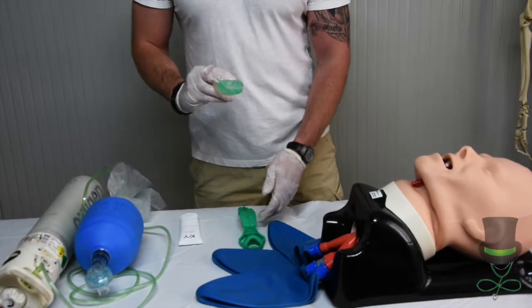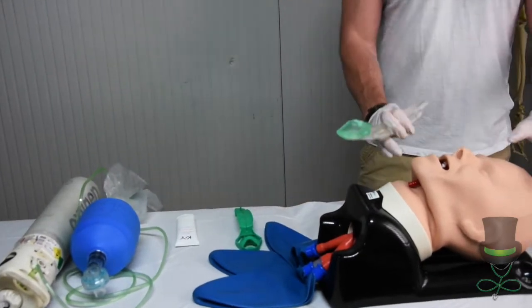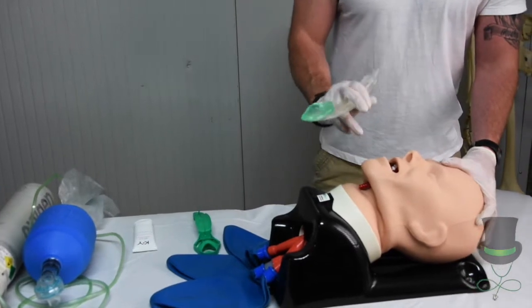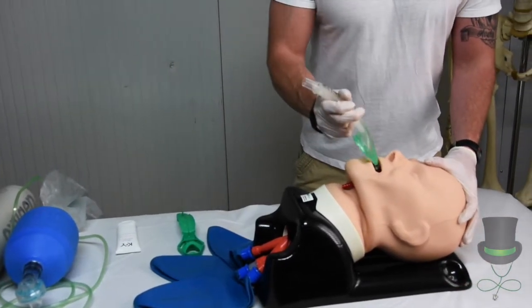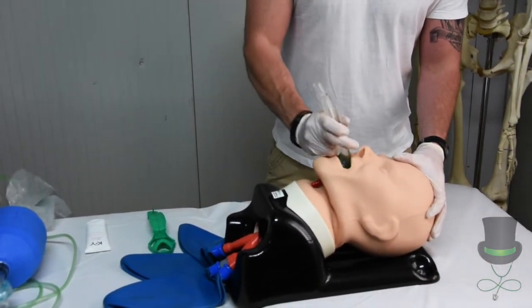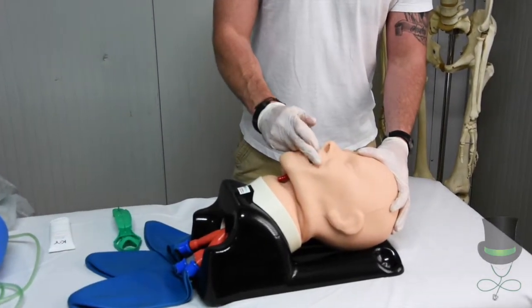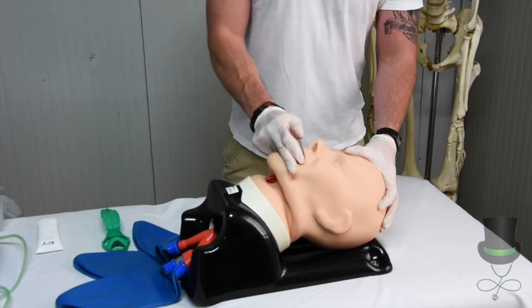Once the mask is lubricated, perform a head-tilt chin-lift on the patient to help with insertion. Place the LMA into the mouth until you meet resistance.